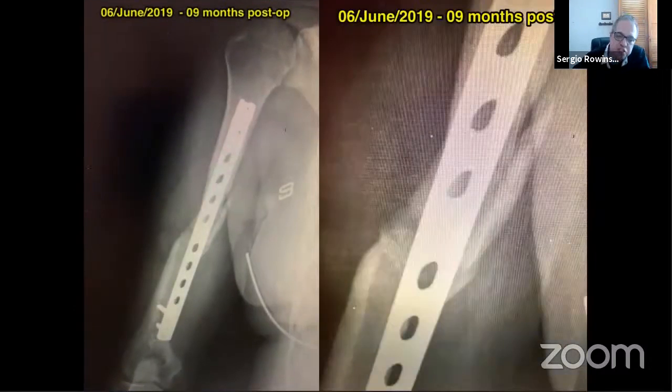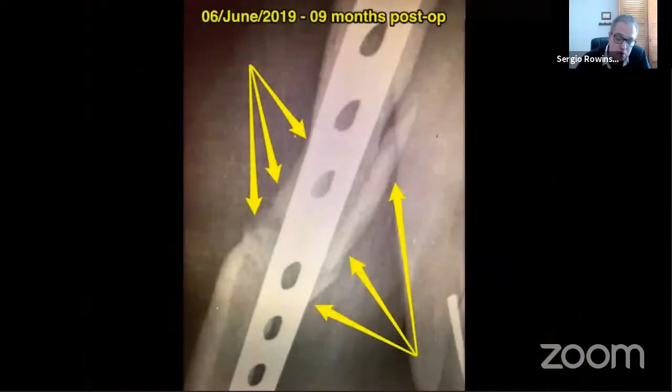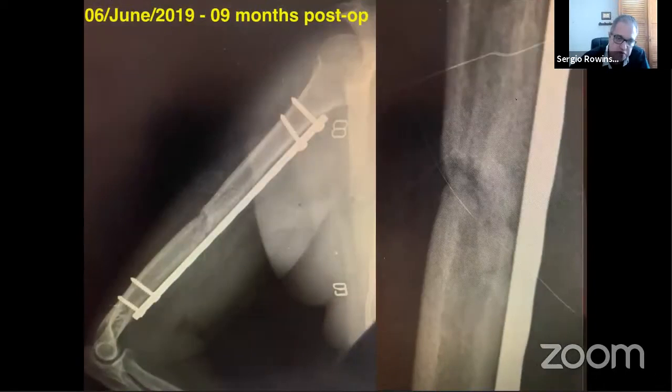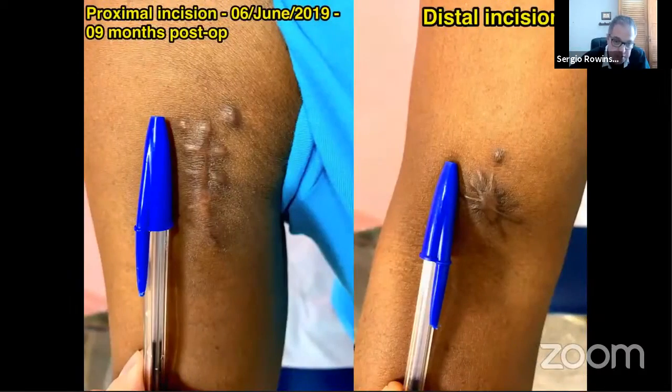This is the day I discharged her. She says, Dr. Sergio, I don't know what I'm doing here. So now we see callus, but this is going to remodel, as I'm saying all through the presentation. Evident healing in the left view. These are the incisions. I am very proud of my distal incisions in terms of size.